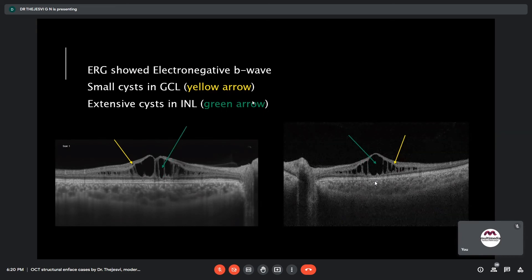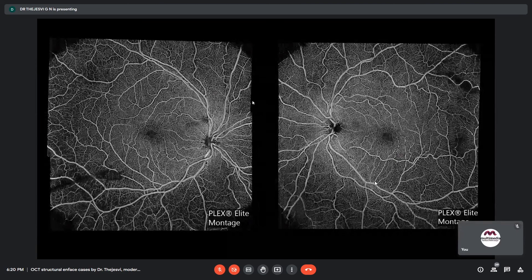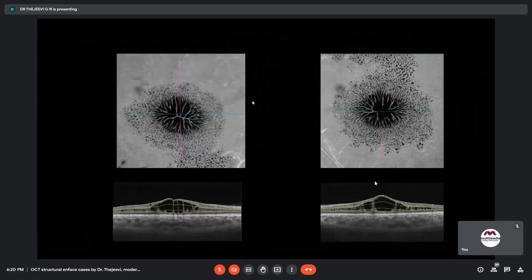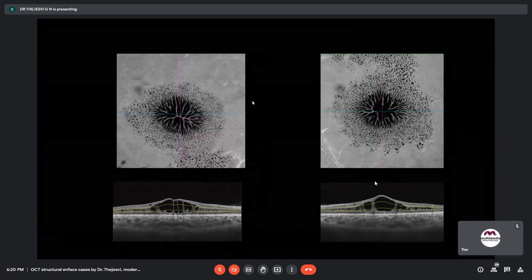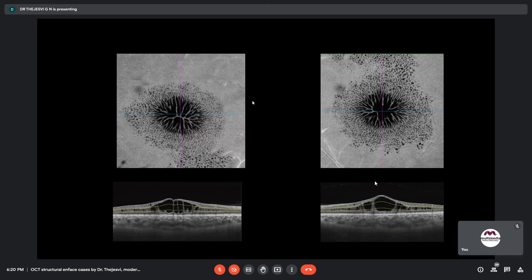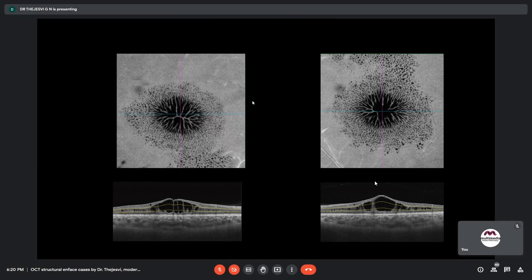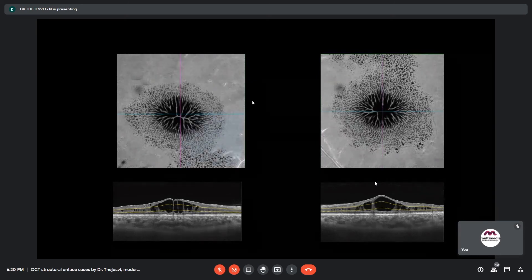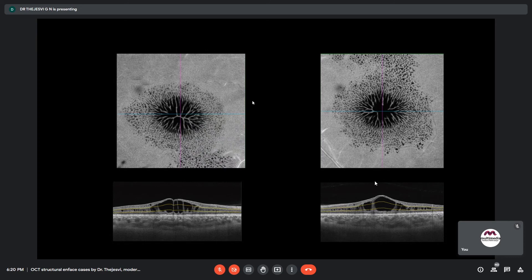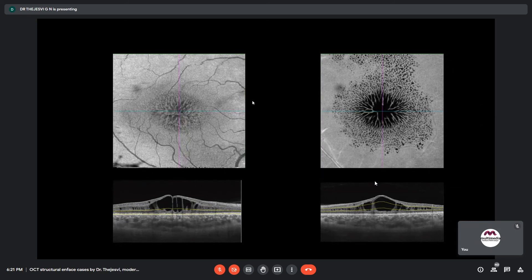Montage of superficial and deep capillary plexus images are shown. The structural OCT en-face of the middle retina shows a hyporeflective cavity at the center of the fovea and radial hyporeflective cavities extending to the parafoveal region with hyperreflective partitions — referred to as a radial spoke-like pattern. Hyporeflective mesh-like cavities in the parafoveal region are referred to as a reticular pattern. The cysts show greater extension in the inferior extrafoveal quadrant in the right eye and superiorly in the left eye. The patient was diagnosed as X-linked retinoschisis based on clinical and genetic assessment. Polygonal changes in the deeper retinal layers are also seen on structural en-face.